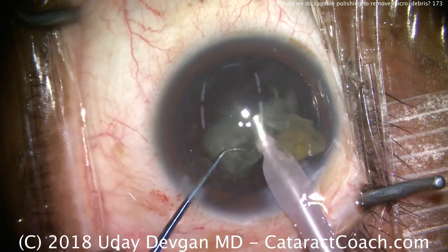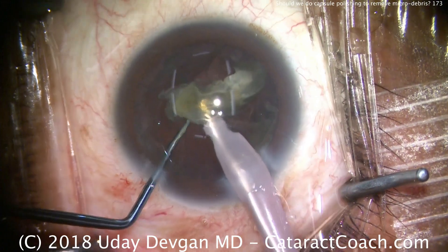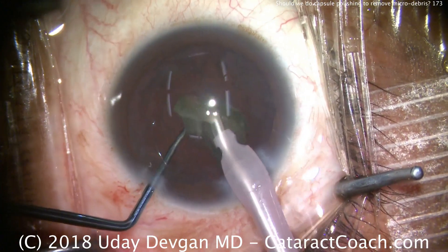Here we go, bringing forward the last bit of the nucleus. You can see it's been very efficient — only about two minutes into the surgery and the entire nucleus is removed.